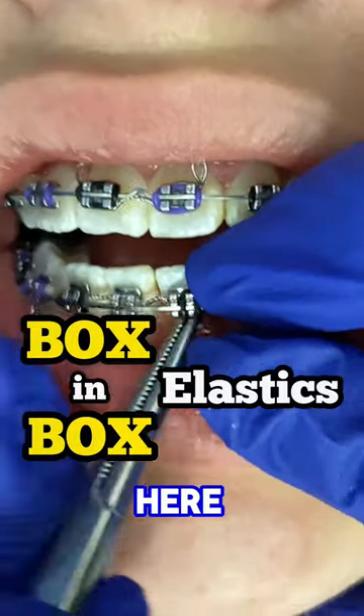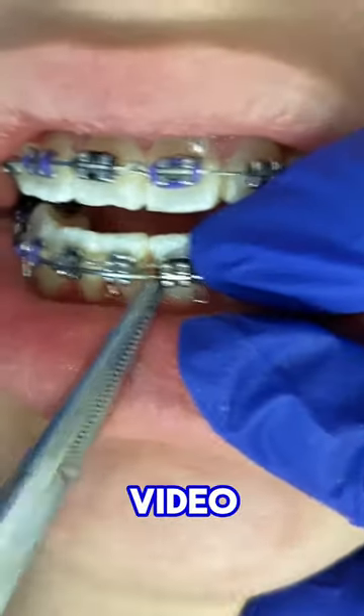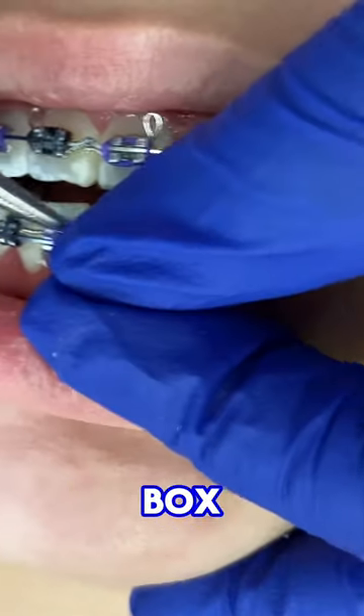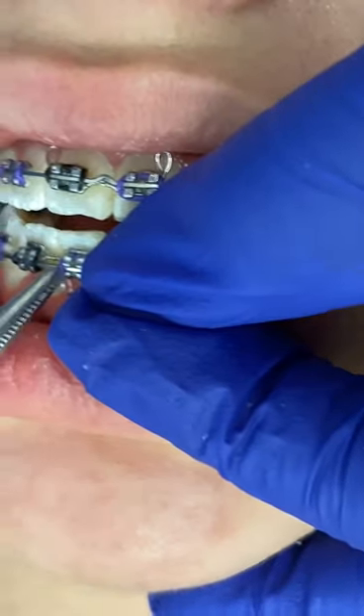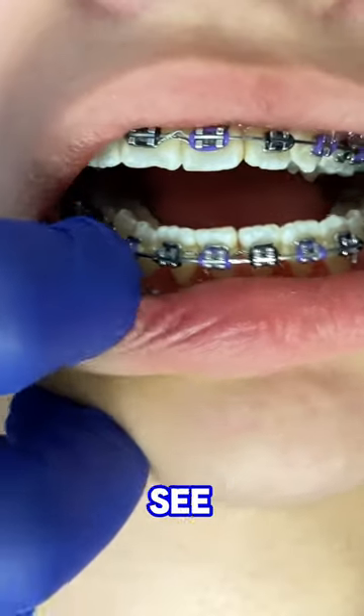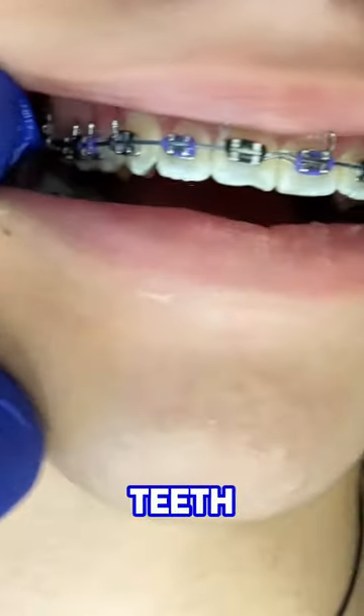Hey everyone, this is Abby, your hygienist here at 210 Family Dentistry. In today's video, we're going to show you how to place box-in-box elastics. As you can see in this video, the patient already has what we call Kobayashi hooks — you can see those on the top front two teeth.